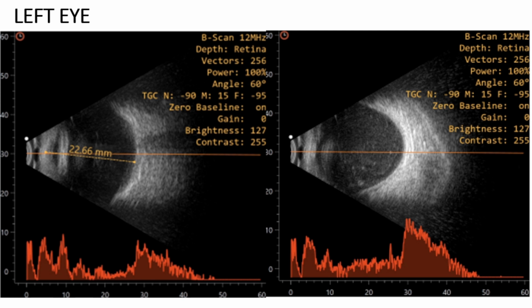Yes. So this is the ultrasound of the left eye. IOL reverberation echoes are not seen here actually. I'm not able to make out. There are a few multiple low to moderate reflective dot echoes seen more posteriorly. The retina appears to be attached, but the optic nerve is not seen in the left or the right side scan.